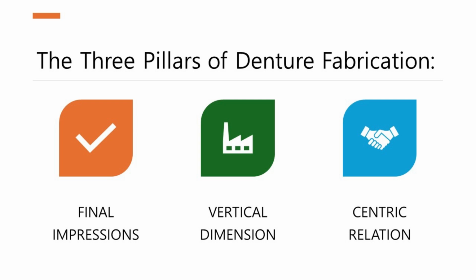Vertical dimension. Determining the correct VD is crucial for the aesthetic and functional integration of the dentures with the patient's facial features. It affects how the patient looks and functions while wearing the dentures, influencing everything from chewing efficiency to facial expressions.